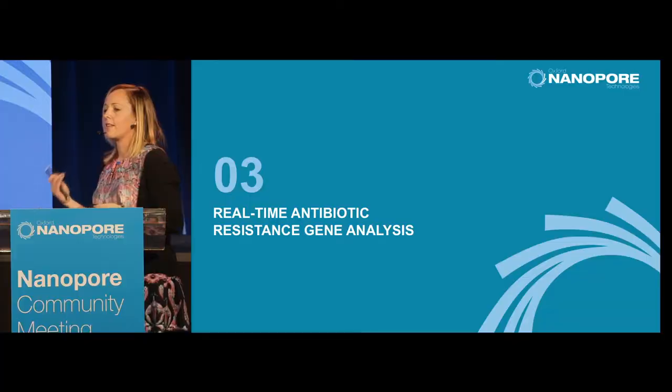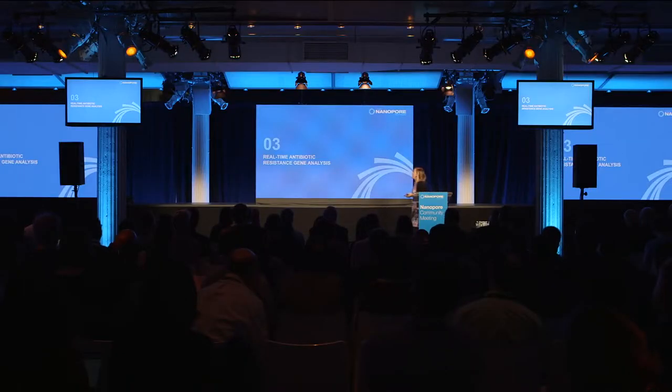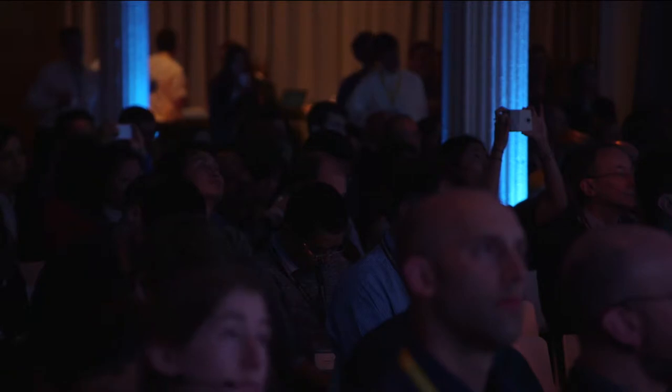And then the last little thing that I'm going to go over with you very quickly is the use of detection of antibiotic resistance genes to predict phenotypic AST results. And I'll do this with a second case. This is a 64-year-old female who is status post-liver transplant presenting with sepsis. She was empirically initiated on vancomycin and meropenem.